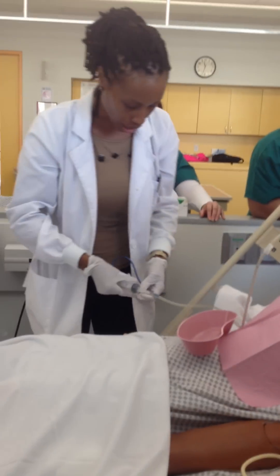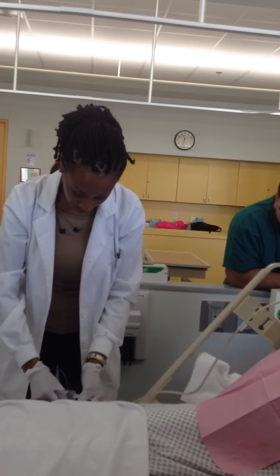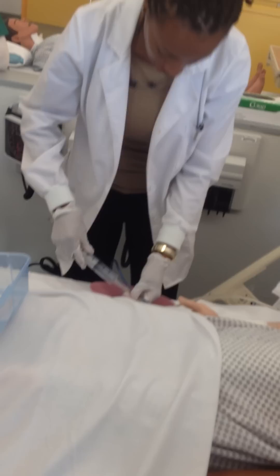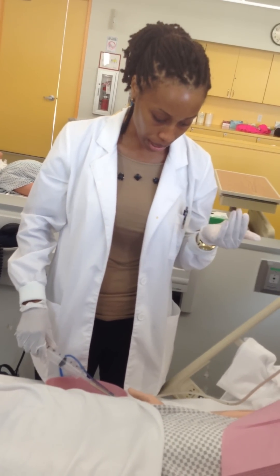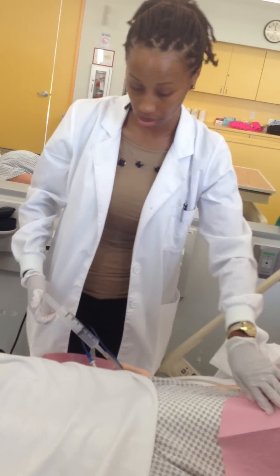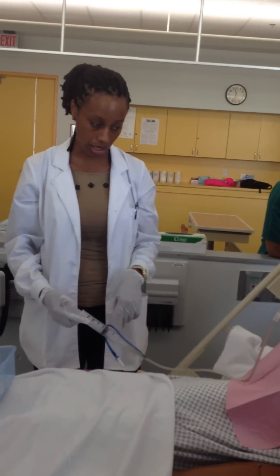Then you're going to check for placement. If you've got fluid backing up, have something ready because when you take this off it's going to gush out. Take the syringe — you need at least 30cc of air — and connect it. Have your stethoscope on and push only until you hear gurgling in the stomach. Once you hear the gurgling, stop. You don't want to push all 30cc in if you can confirm earlier, because you're giving them gas and they'll be burping — making them uncomfortable.